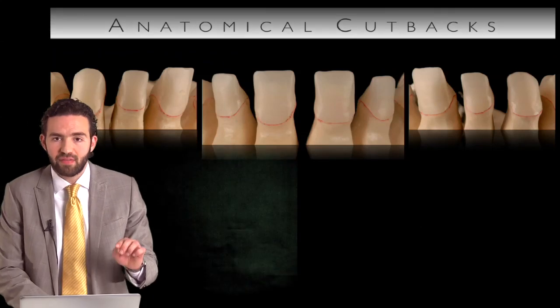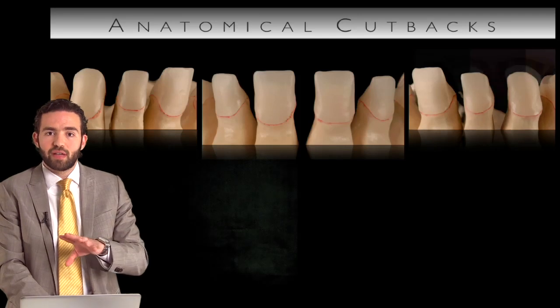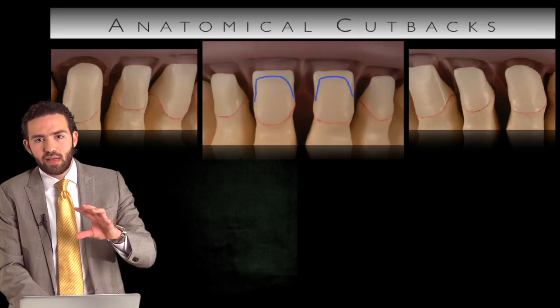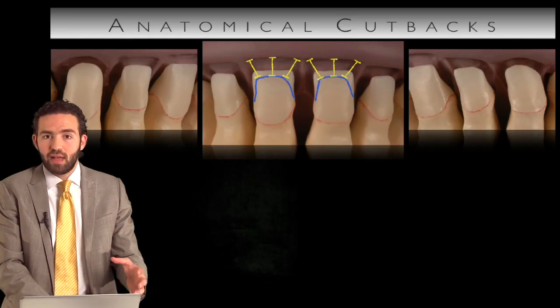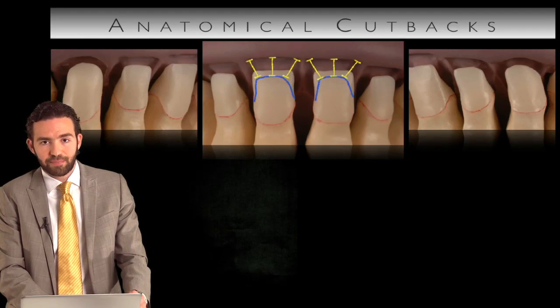Always have to have anatomical cutbacks. In the old days, we used to provide cutbacks that were really just 0.4 or 0.5 millimeter even layer, and that provides amazing amount of unsupported porcelain, and that's where the chipping most of the time happens. But nowadays we know better, and we know that we have to provide anatomical cutbacks for our restorations.